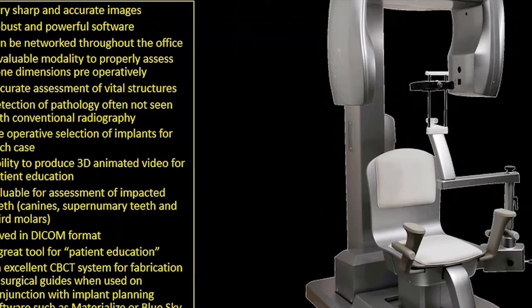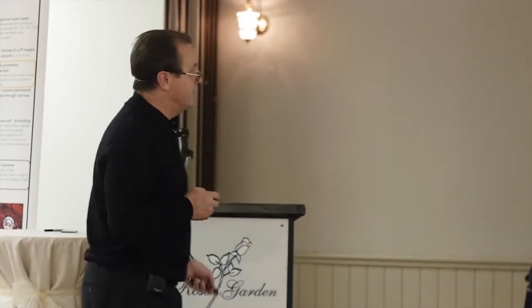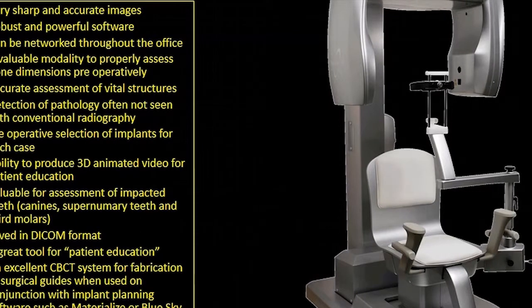It's great for assessing bone dimensions, accurate assessment of your vital structures, detecting pathology that a lot of times is not seen with conventional radiography. I mean, the number of cases where this tooth is really bothering, and I think I maybe see something on the x-ray, not real sure, take a CT, big old lesion, and it just doesn't show up in 2D radiography. Preoperative selection of implants for every case.